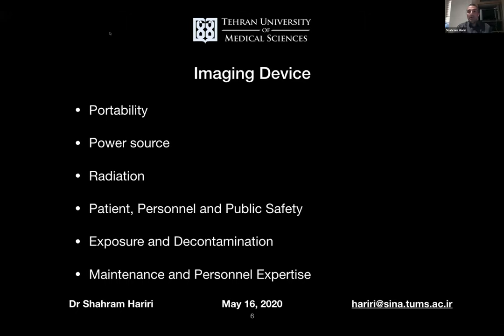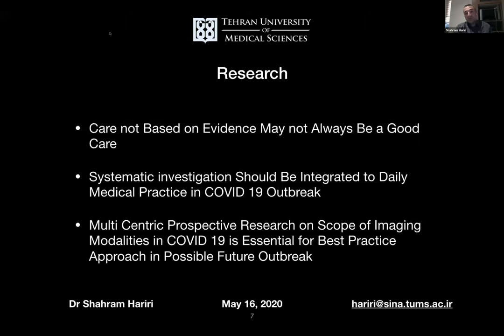Disinfecting protocols will also reduce the pace of the imaging center, and complexity and expert personnel requirements also play key roles in medical imaging centers, which sometimes provoke limitations in these situations. Introducing handheld ultrasound devices that run on a rechargeable battery for hours, are almost absolutely portable, and are packed with user-friendly imaging applications, is a game changer in this extreme situation.